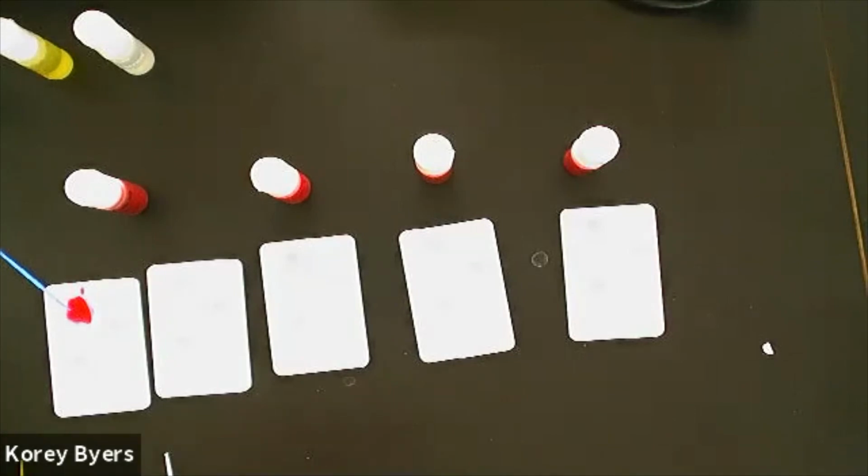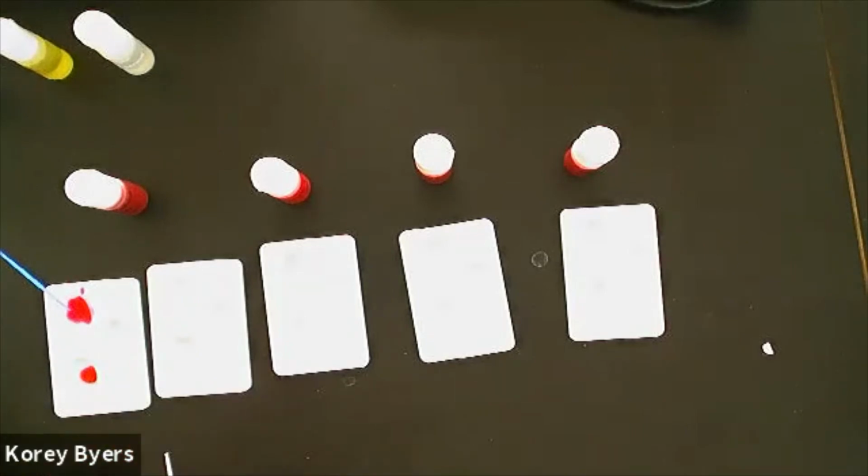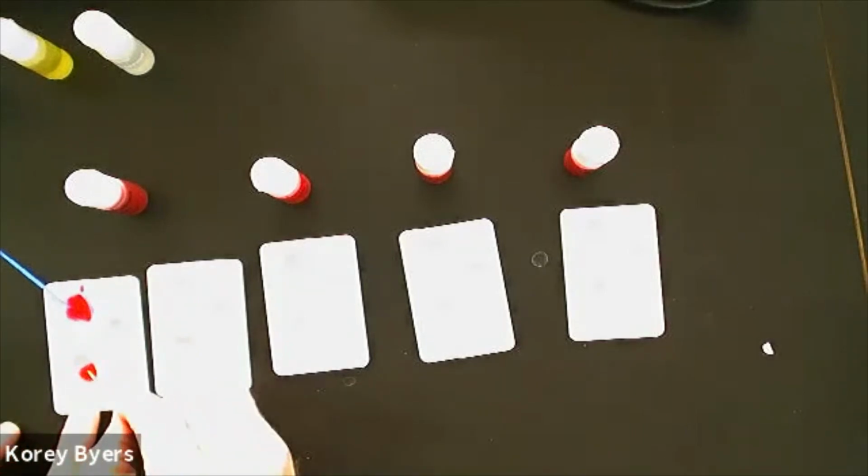Let's move to the B. Put 1 drop of June's blood in the B well, and then take your yellow toothpick and stir. Can you notice the difference? If you don't, keep stirring.